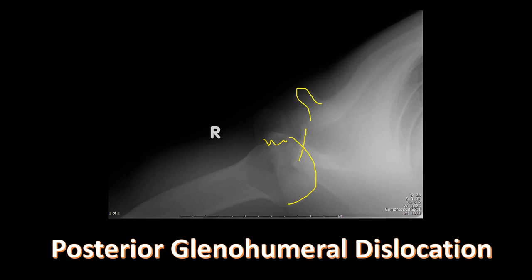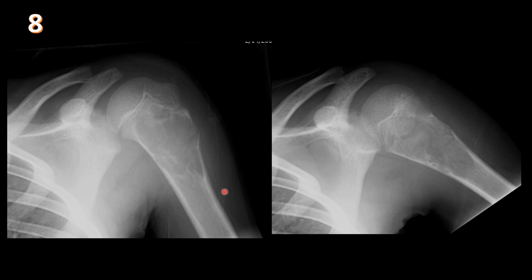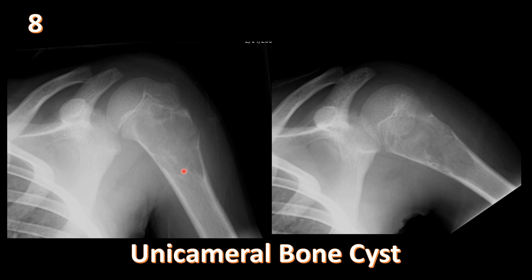AP views of the left shoulder in internal and external rotation in a skeletally immature patient show a bubbly lucent lesion within the proximal humerus with cortical disruption laterally — a pathological fracture through a unicameral bone cyst. Unicameral bone cysts are common in the proximal humerus in skeletally immature patients, are benign, and may show endosteal scalloping and bubbly septations. The fracture demonstrates the trap door sign — a cortical fragment hinges inside the cyst — also called the fallen fracture fragment sign when the fragment lies in the dependent portion.